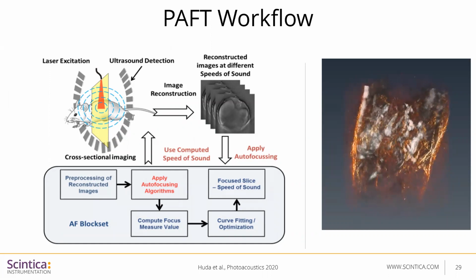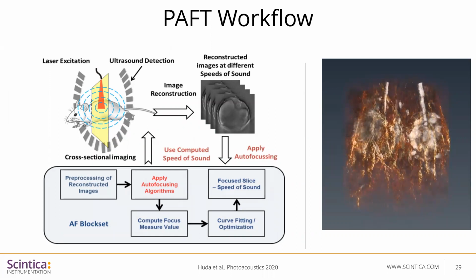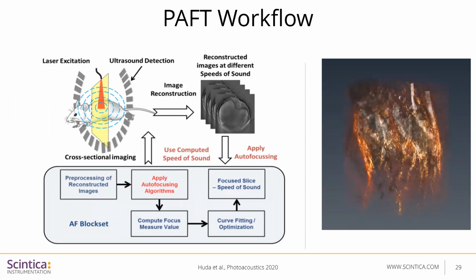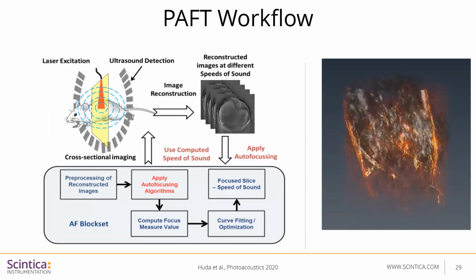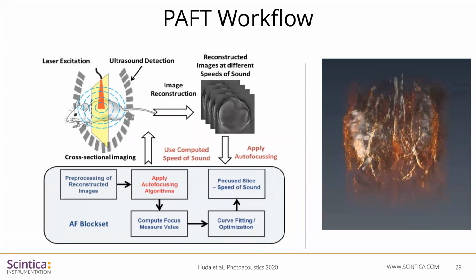This is an example of a 3-dimensional image using the PAFT system. This is actually the placenta within the abdomen of a pregnant mouse, and there are different regions which are being depicted in this image 3-dimensionally.